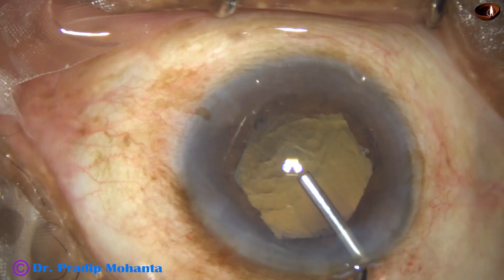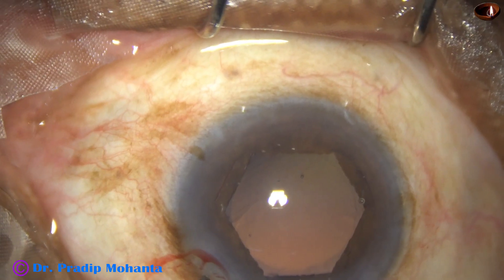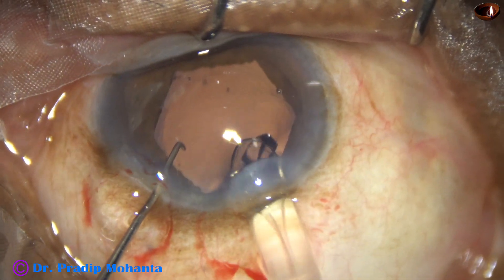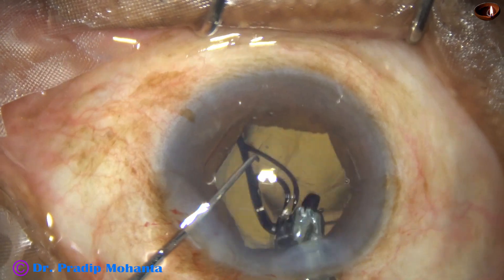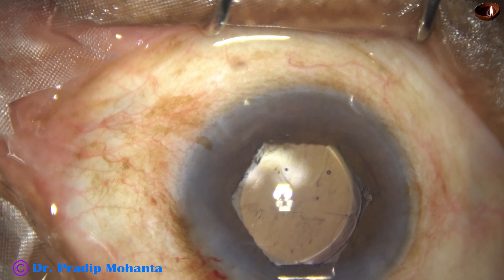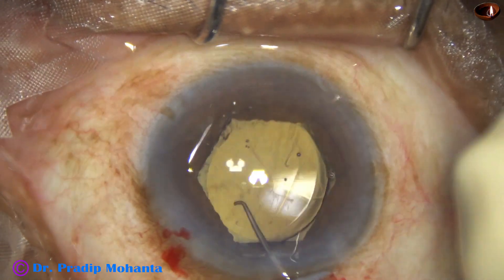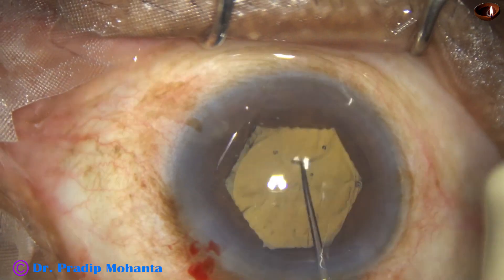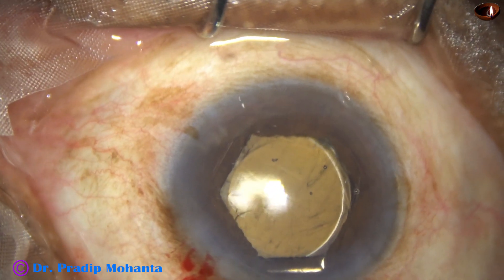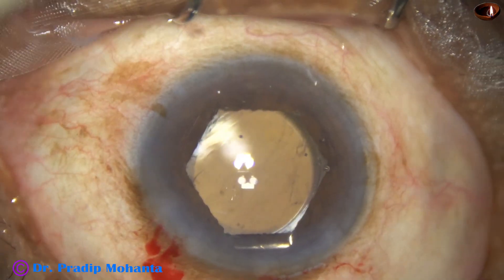Inject viscoelastic and now is the time to implant an intraocular lens. In this case, we are implanting a hydrophilic acrylic single-piece monofocal intraocular lens. The leading haptic goes into the capsular bag and the trailing haptic must be placed beyond the B-hex flange, otherwise it can push the B-hex flange behind the eyewall and then it becomes complicated maneuvers. The intraocular lens has gone into the capsular bag.